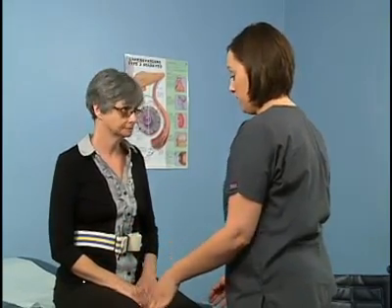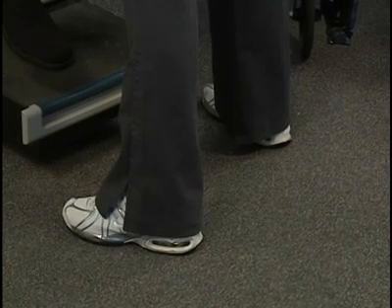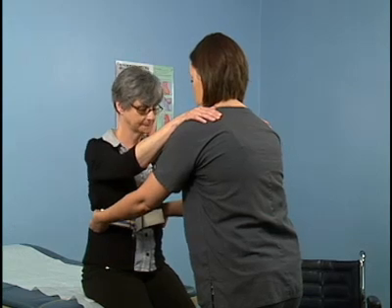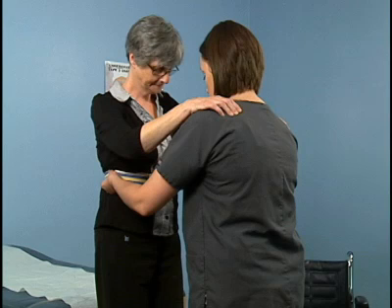Ask the patient to place her arms on your shoulders, but not around your neck, as this could cause an injury. Stand in front of the patient with your feet apart, one slightly in front of the other and knees bent. Grasp the transfer belt on either side of the patient's waist using an underhand grasp and instruct the patient to stand on the count of 3, using the muscles in her legs and thighs. Straighten your knees and assist the patient to stand by pulling upwards on the transfer belt.